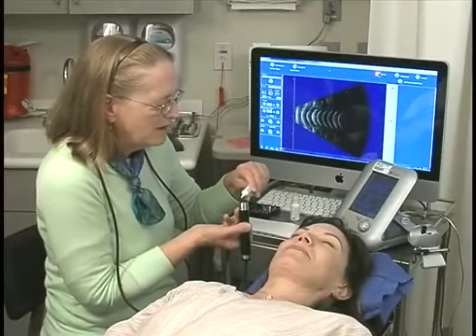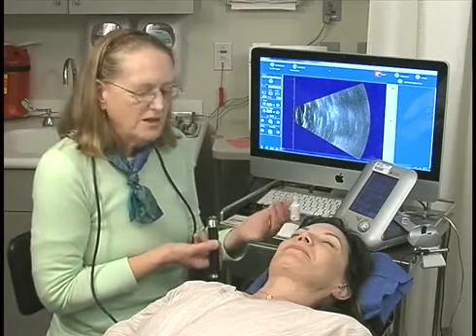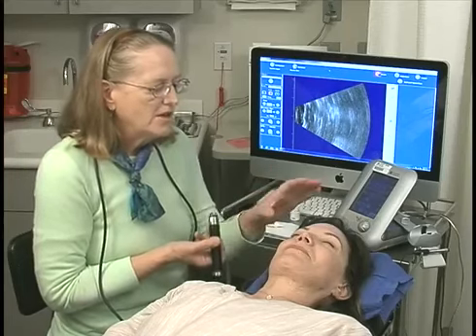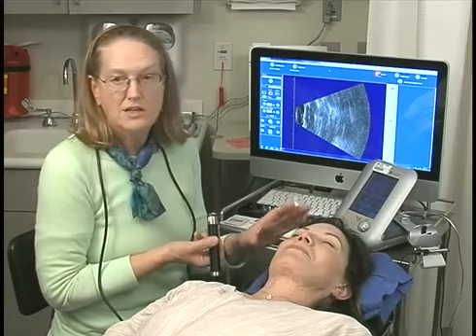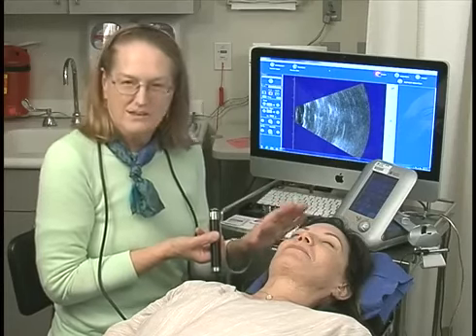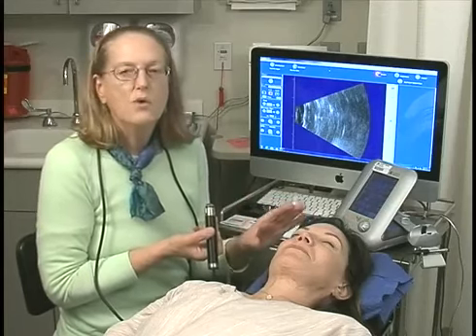The final 10 megahertz B scan positions are axial scans. I leave them for the last because of two reasons. Number one, with all the other exams, we avoid the lens as much as possible. The crystalline lens, and definitely an intraocular lens in an eye, will act like a lens to the sound beam and cause a lot of aberrations in the image. So we normally avoid the lens.